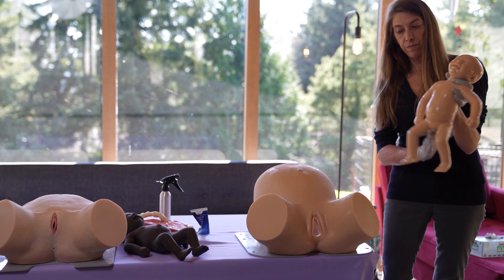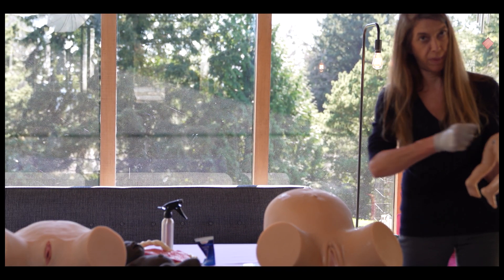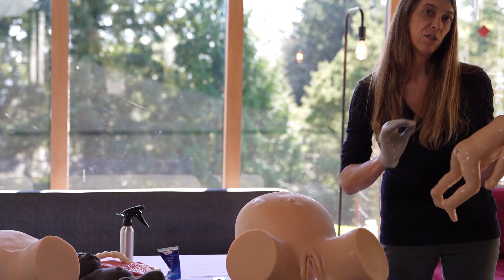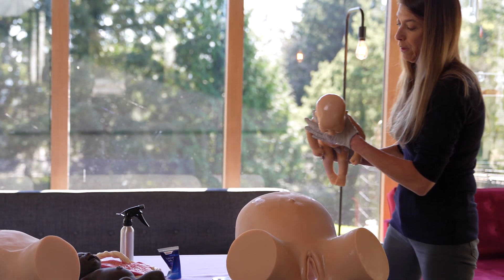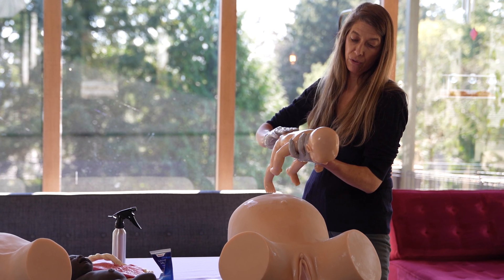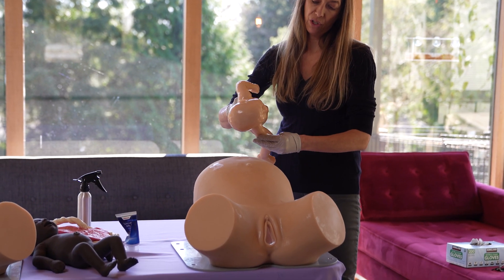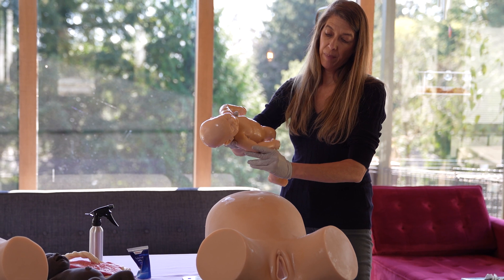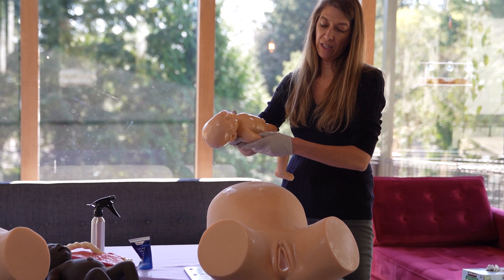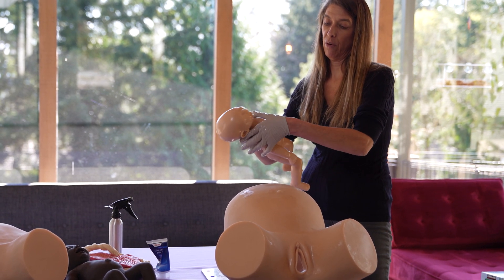For a shoulder dystocia, you place the baby inside the mom. You can either use the task bar that comes with the model to screw it into the bum and pull back, or I just dig my fingers into her hip bone — it's much easier for me to release and allow the delivery to continue. Once I put her in, I pull back to give the turtle sign, then determine which way the baby is going to face. I'm also in control of the level of the dystocia — I can place the arm straight along the side, or start with it up a bit so it's not quite as difficult, then move to having it straight where they need to follow the arm down, do that bend, and sweep the arm up and over baby's face.